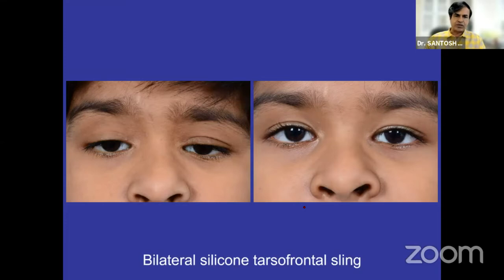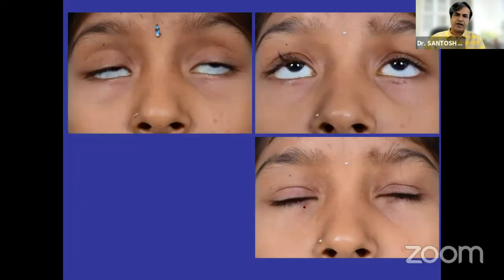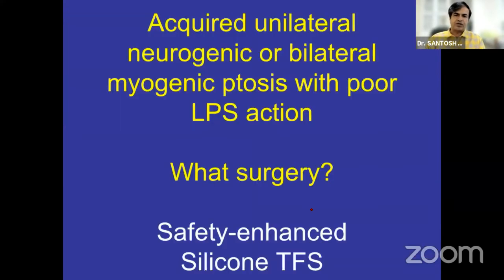This is a bilateral tarsofrontal sling, and this again is a bilateral tarsofrontal sling. You can maintain lid crease symmetry as well as eyelid height symmetry. The advantage of silicon is that closure is much better than any other material since it is so elastic — patients can close their eyes with minimal 1 to 2 mm lagophthalmos. Nocturnal lagophthalmos may be slightly higher.